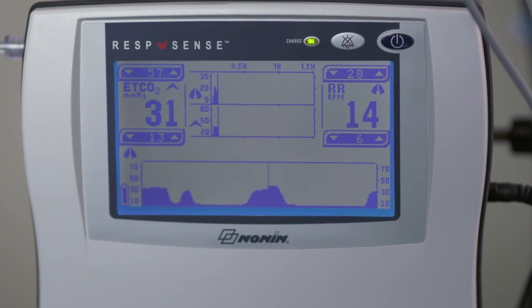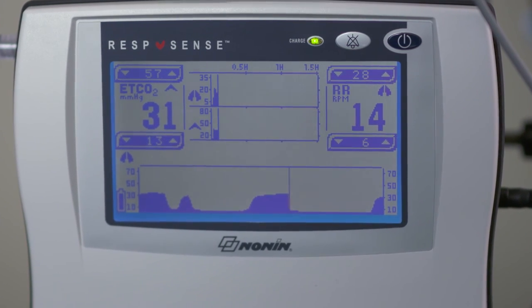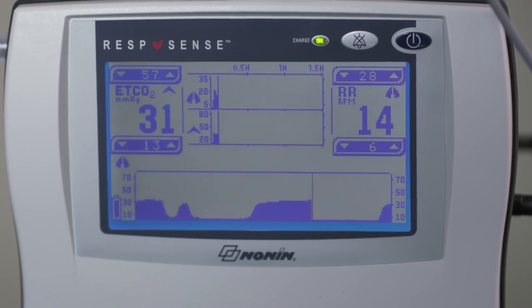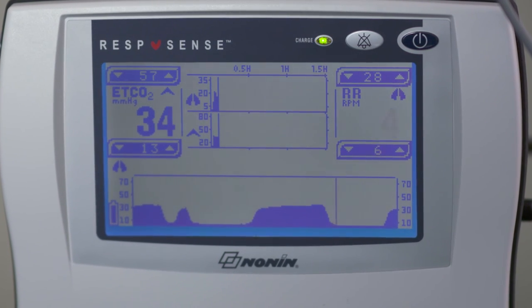If the patient begins to hypoventilate, you may see the breaths become farther apart as the respiration rate slows or the height of the waveform increase as the CO2 increases.